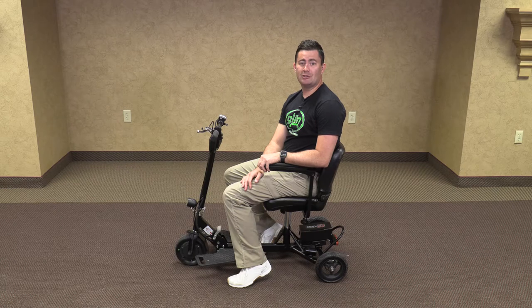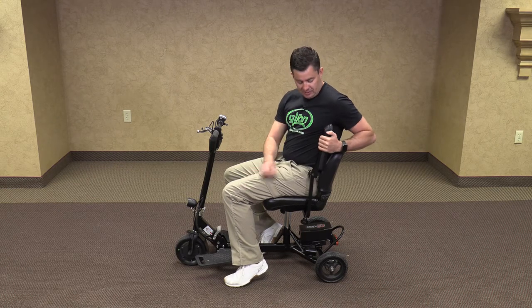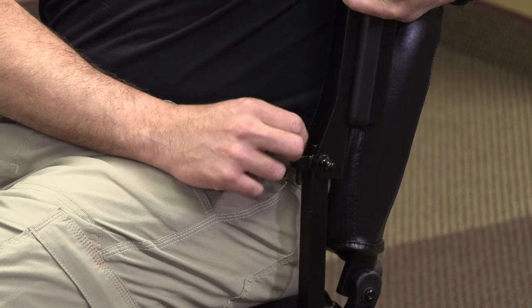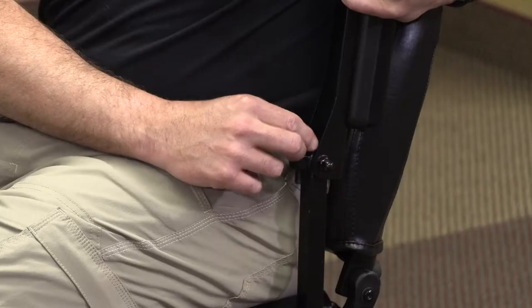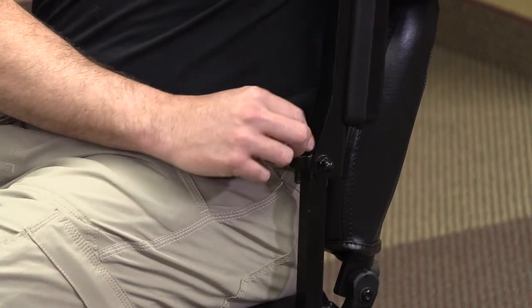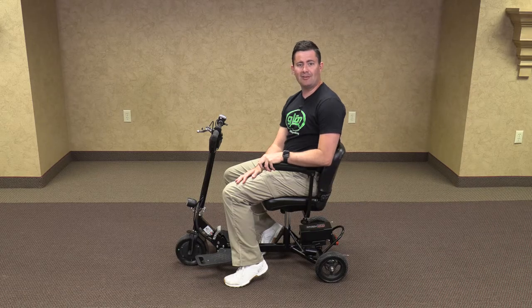Now I'm going to show you how to adjust the height of the armrests. First you'll want to raise the armrest up, and underneath is a bolt that you'll want to loosen — righty tighty, lefty loosey. A left turn loosens it and raises the armrest higher. Tightening it, going to the right, lowers it to your comfort level.